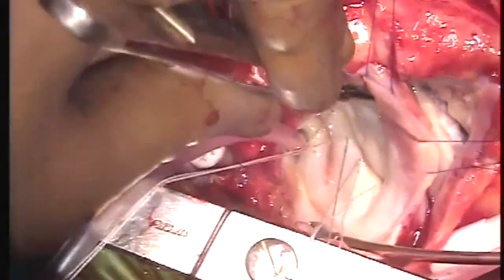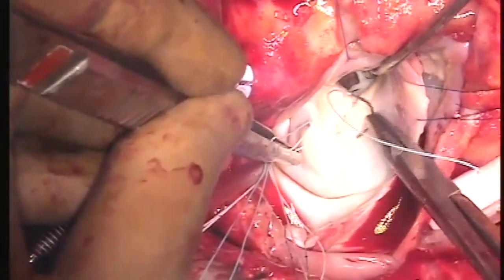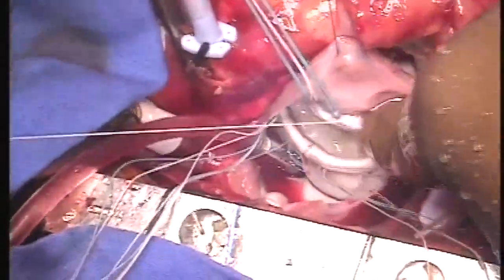The mitral annuloplasty sizing is performed with a ring. A 30 size ring, that is Medtronic 3D profile, is used for annuloplasty. Now the saline testing shows a competent mitral valve.